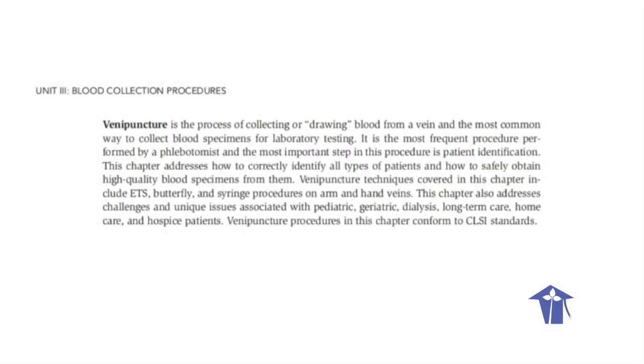Morning class. Today we're going to do the venipuncture procedure. This will include steps 1 to 20. Step 1, review an accession test request.